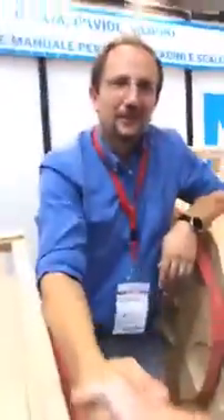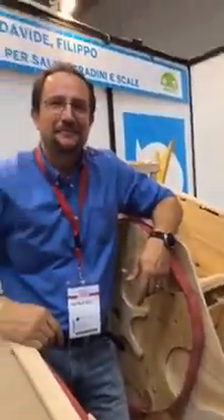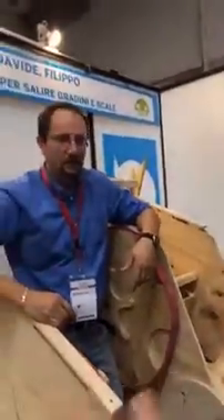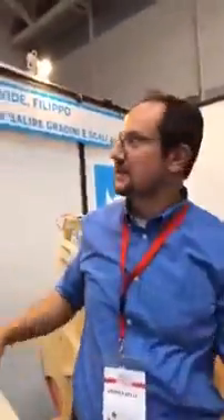I'm with Maker Faire Global. I go to Maker Faires all over the world and we stream video live for all the people who can't go. I came by yesterday, I saw you giving a demonstration — I thought this was wonderful. Would you mind telling us about your project? The project is a manual wheelchair to climb the steps and the stairs.